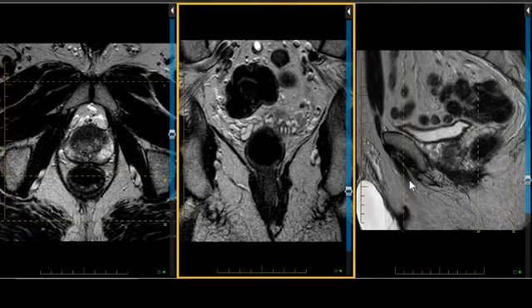Okay, let's take a 62-year-old man with a PSA level of 41.32 in December of 2017, and then a PSA that rose to 53.97 nanograms per ml on 2/26/18. The patient has had two negative prior biopsies, one in 2014 and one in 2015.